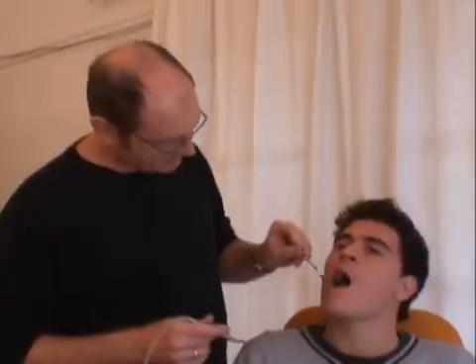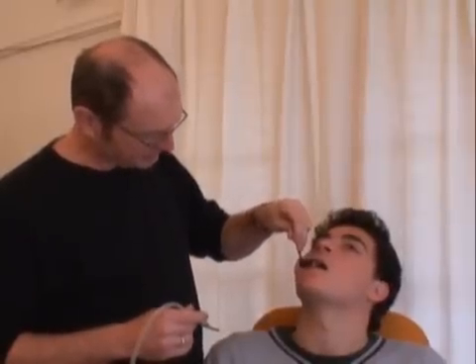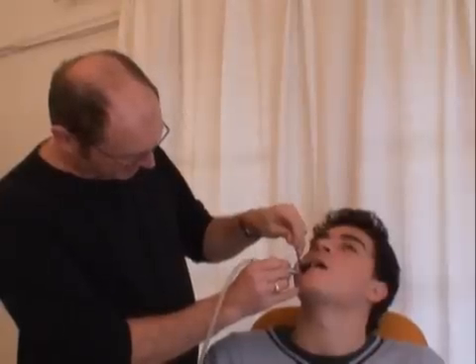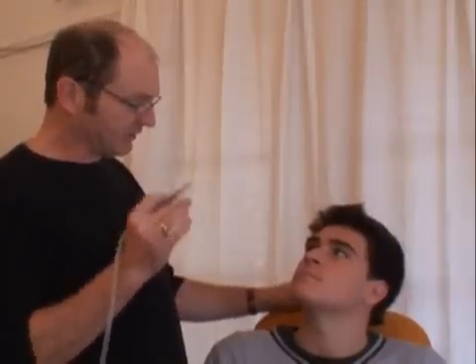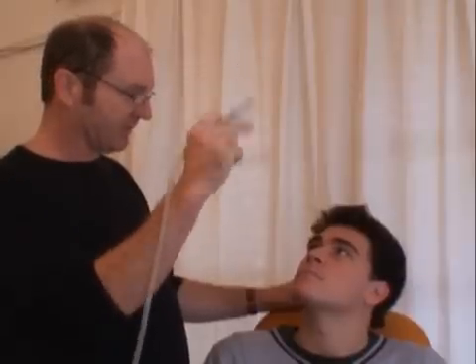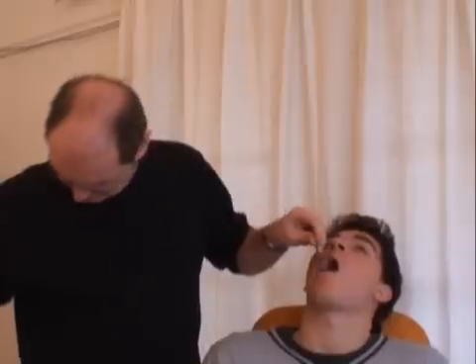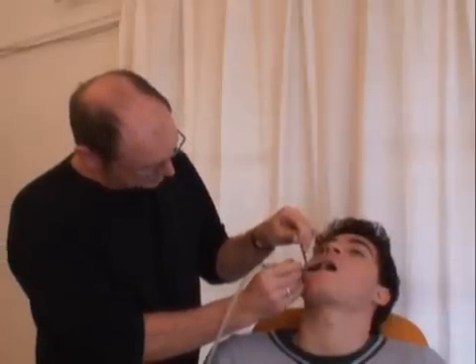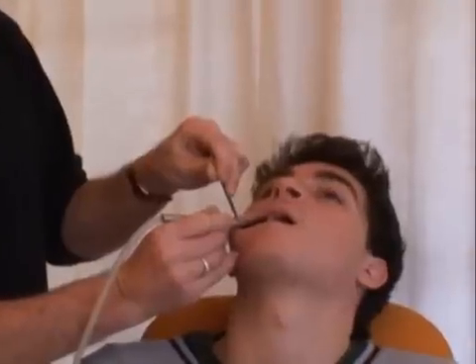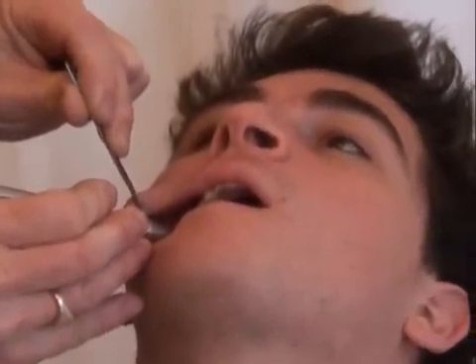If you had a small area of decay between teeth, this is actually much more difficult to treat conventionally and also with the current range of ozone instrumentation. Conventionally, if you had a little hole between two teeth, we would actually drill a hole in both sides — you wind up with two fillings, often referred to as the Australian trench, where you go from one tooth to the next and put a filling the whole way along. With ozone, we can actually tweak between those teeth. You literally just hold it straight between those two — it's exactly the same timing. A very simple way to heal.